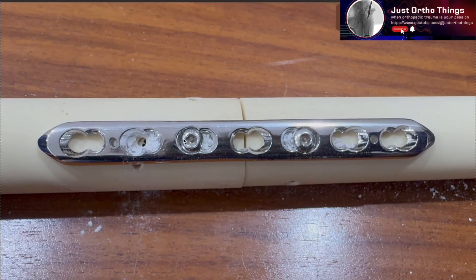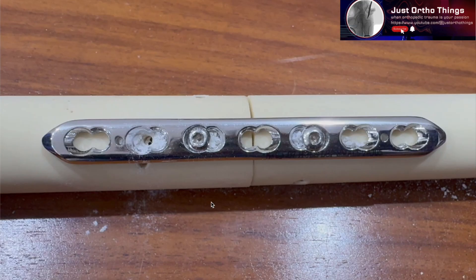The order of placing these two screws can be changed — you can place either first — but the principle remains the same: both screws must be placed eccentrically, and you must loosen the first screw before tightening the second. To summarize: to get 2 millimeters of compression using the two cortical screw technique, loosen the first screw before tightening the second. This will achieve good compression. If you have any queries, please ask in the comments. Thank you.